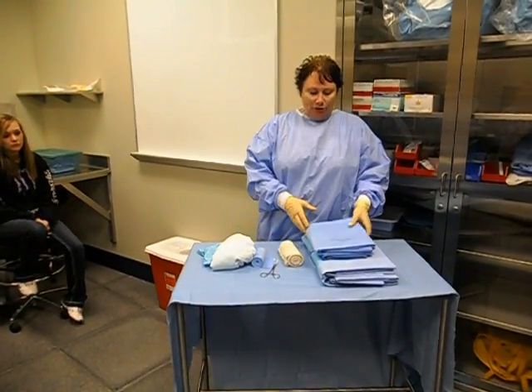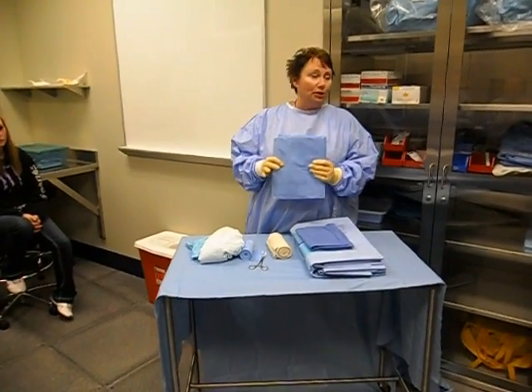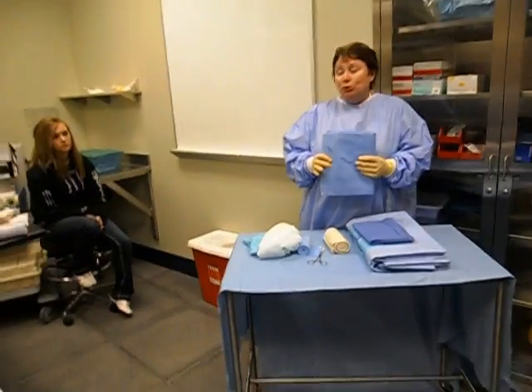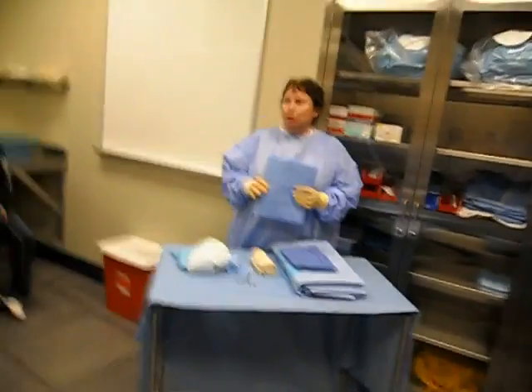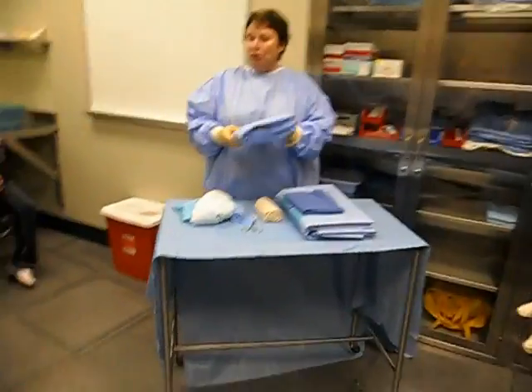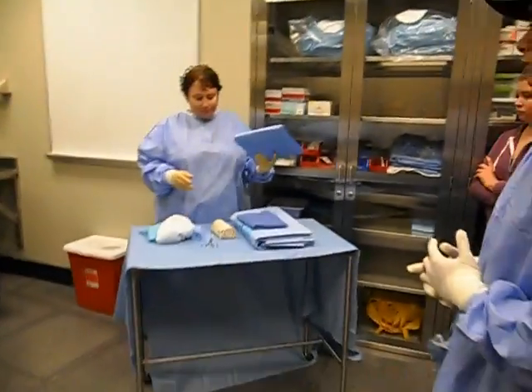For this competency, you're going to use some sort of under-the-leg drape. It could be a three-quarter sheet, it could be a half sheet, you could use a table drape, or you could use a gown upside down if you needed to. And so we're going to use a sheet first, followed by a towel.